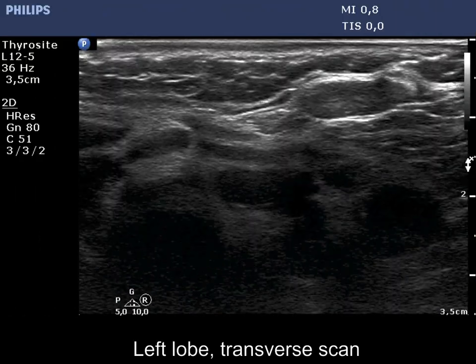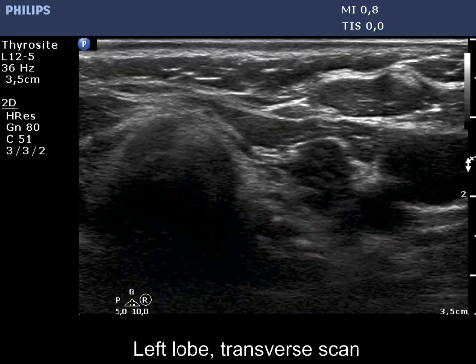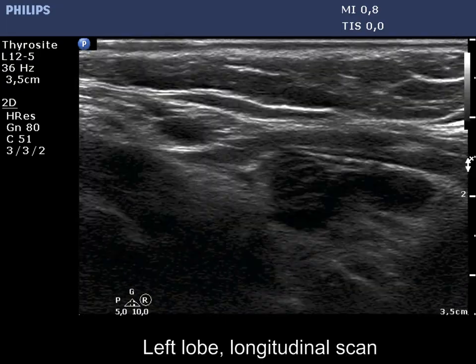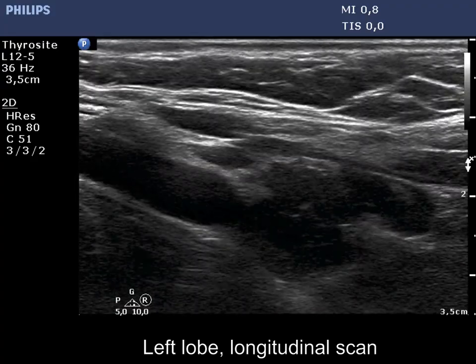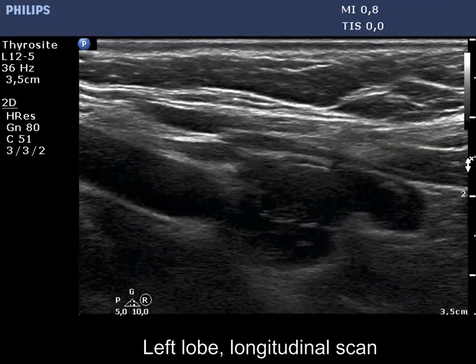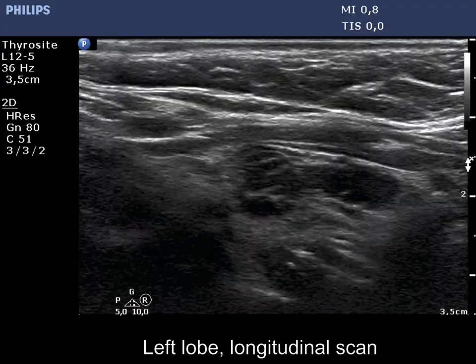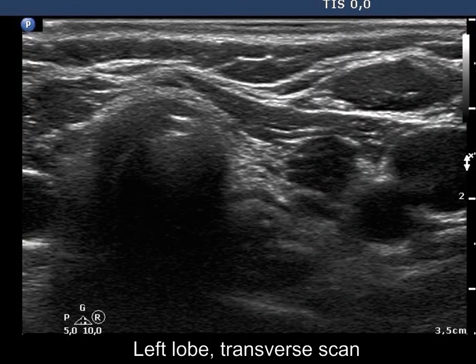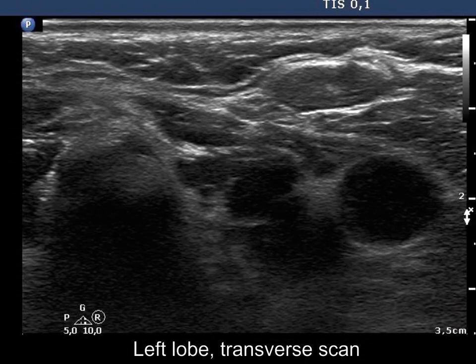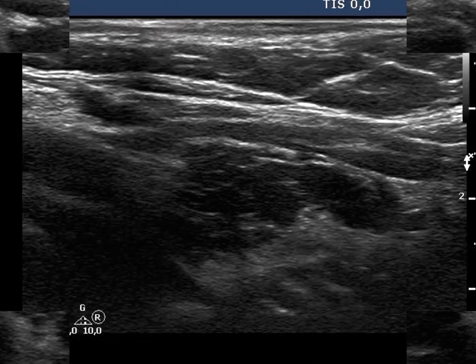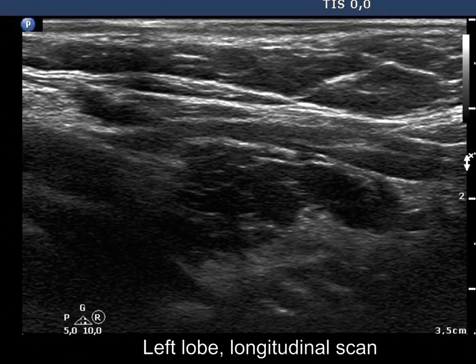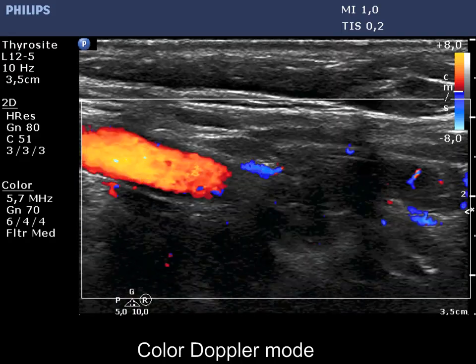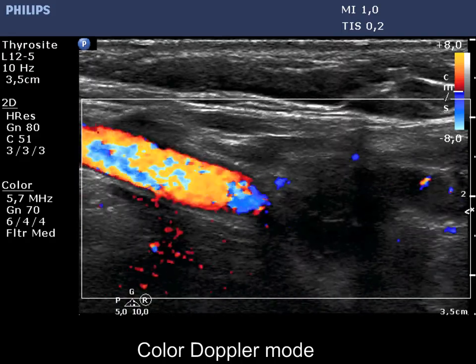The lobe is composed of a central hypoechoic area surrounded with a less hypoechoic rim. The hypoechoic part consists of discrete hypoechoic areas divided by connective tissue. This is the so-called pseudonodular or pseudolobular pattern of Hashimoto's thyroiditis, which is not infrequently misinterpreted as a multinodular goiter. The vascularization is not specific.